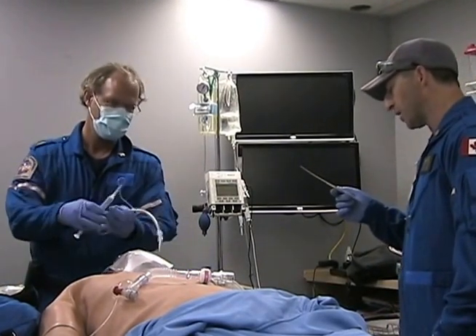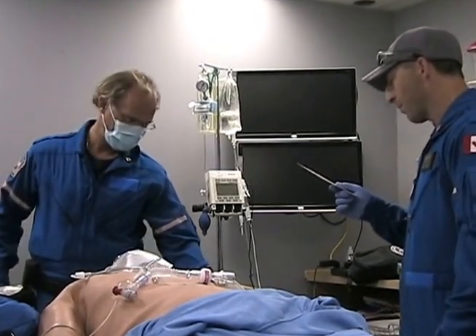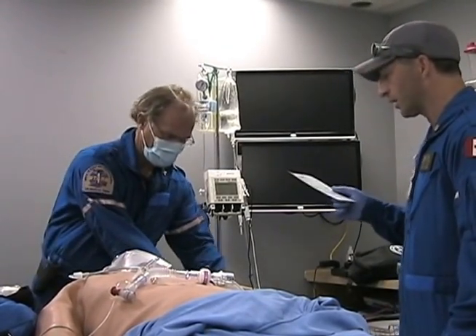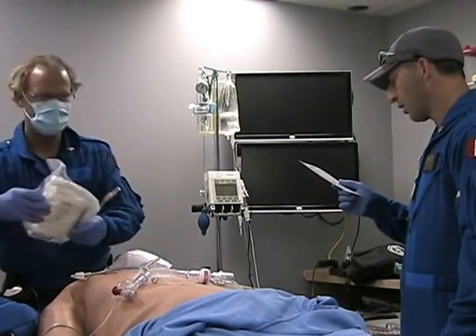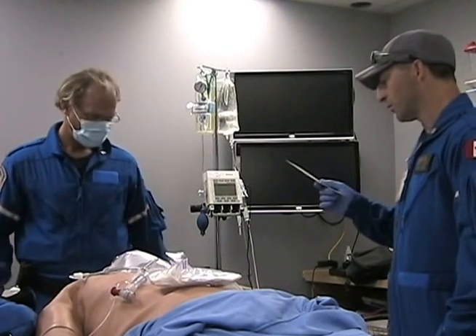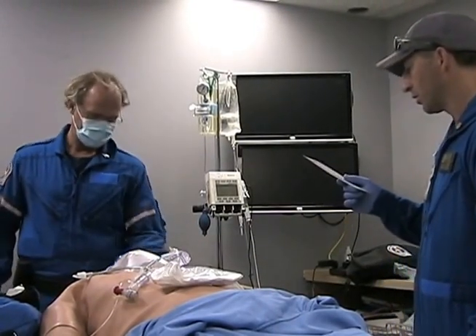Endotracheal tube size, cuff tested, syringe on, lube, bougie plus or minus stylet. There. Backup airways: LMA, King LT, crike kit. Okay, LMA is here, and the crike kit will be out. We'll do an open crike kit, and it'll just sit on his belly. End-tidal CO2 initialized and working. End-tidal CO2 is on. ET tube holder. The tube holder is here.